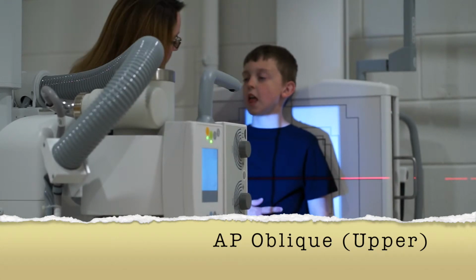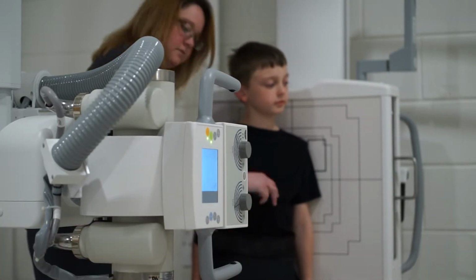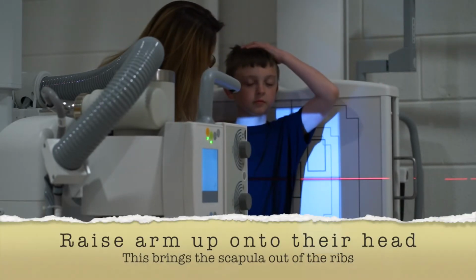Okay, Luke, we're going to get another picture. I want you to turn your body right there. And can you take your arm and put it on your head? Good job.